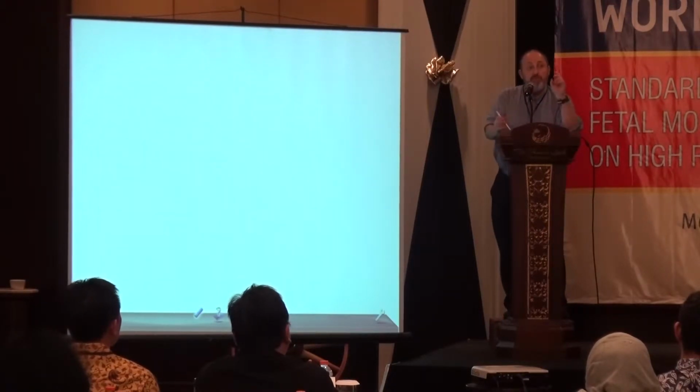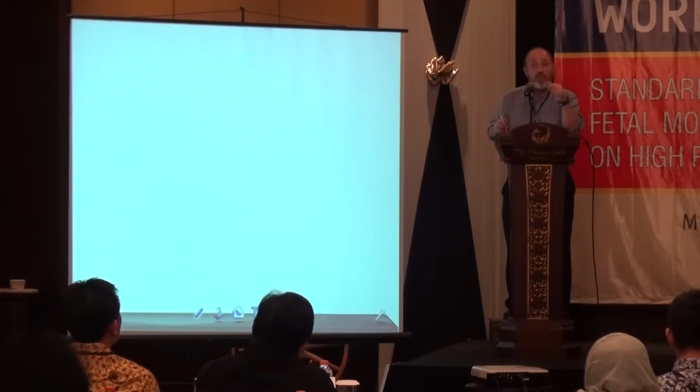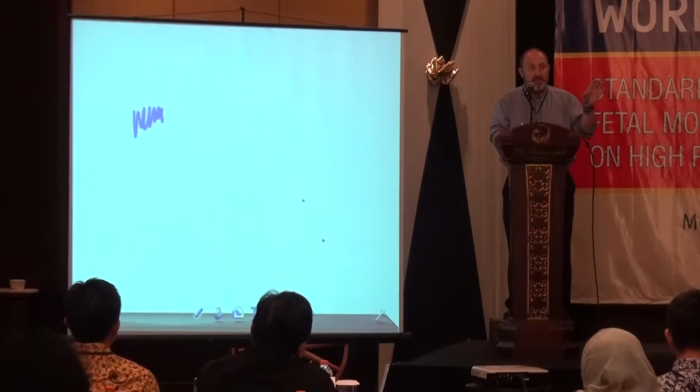So my next tip is, if you have decelerations, ask yourself the question, are they gradual onset or gradual recovery? If the answer is yes, you must conclude that they are earlys or lates. If the answer is no, they must be variable or prolonged. And prolonged are easy. Yeah? Okay? So variable decelerations also display these features. And all of this is on your slides, and we'll go through this briefly in a moment.